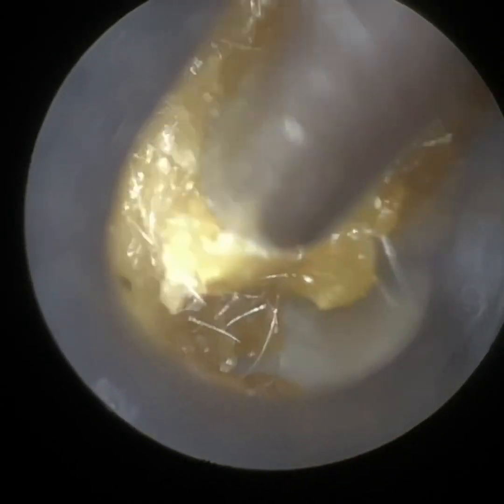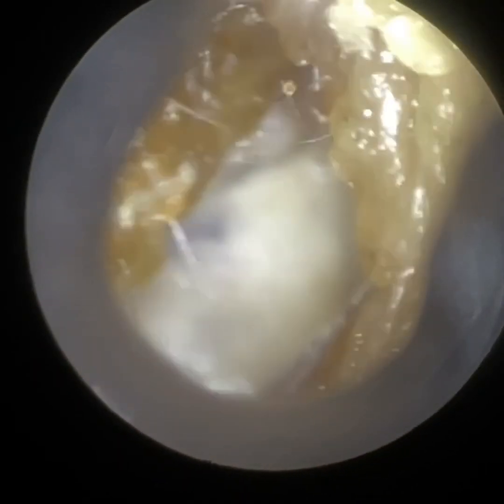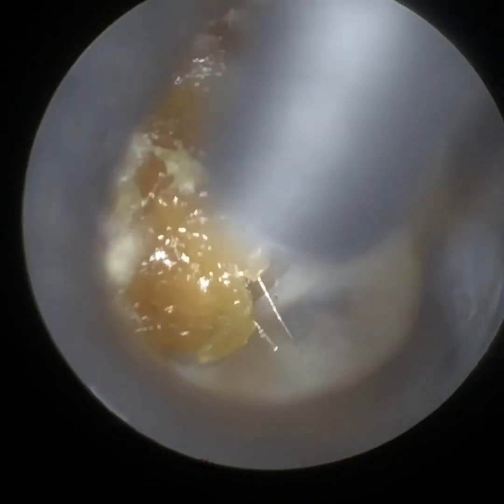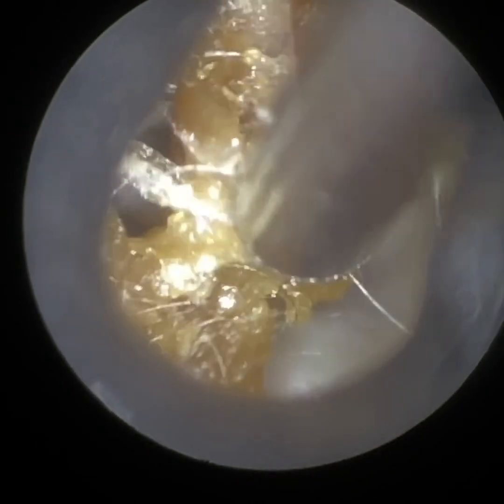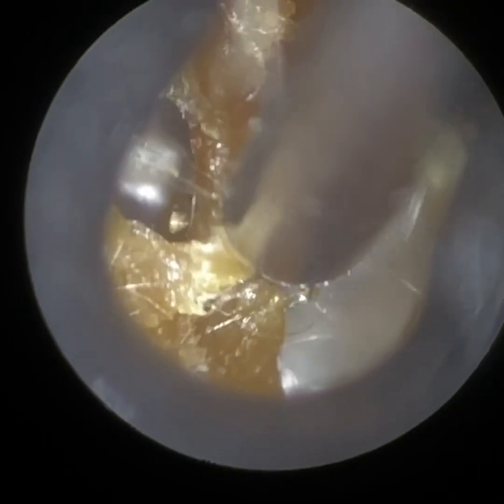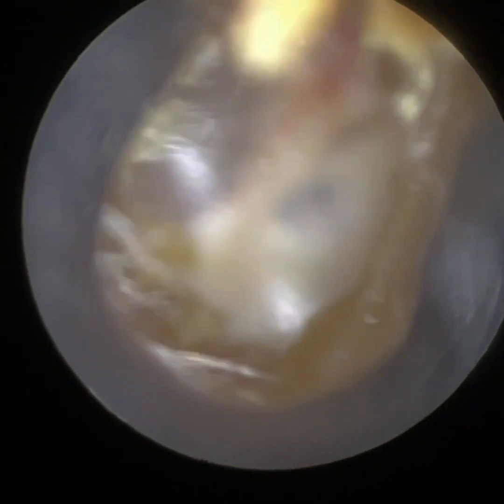So the initial view you saw there was an endoscopic view, and that's with our flagship product, the iClearScope, which is still available to purchase. But I'm just using the WaxScope to remove this dead skin wax. This is impacted on the patient's eardrum. Now this patient is a regular patient — they tend yearly to have this dead skin removed. So this skin has shed from the eardrum but it's failed to migrate, and it's just attached itself quite medially, causing an occlusion.